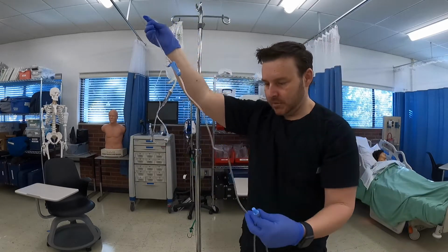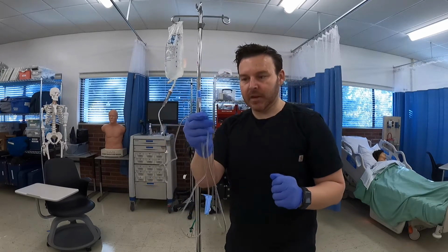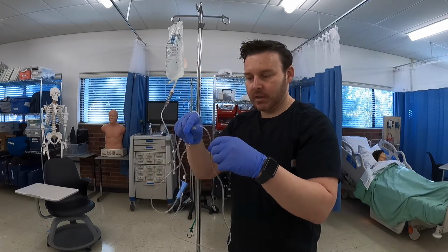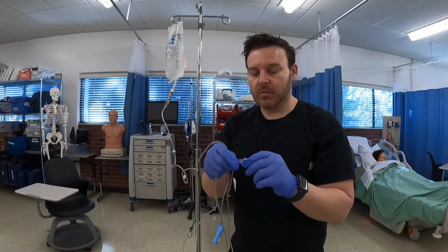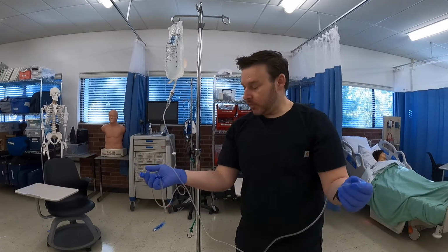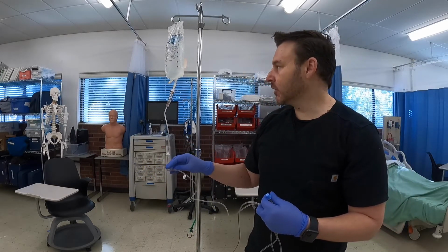It appears that I do not have any. Perfect. And then again, I kept my little cap on. And so now, this is what we would hook up to the patient in a minute. Okay, so now we've primed the tubing. There are no air bubbles, and that's the goal, to get rid of all the air bubbles.